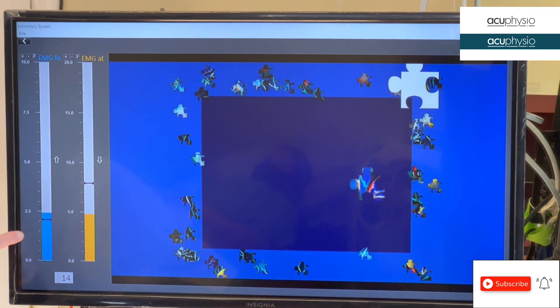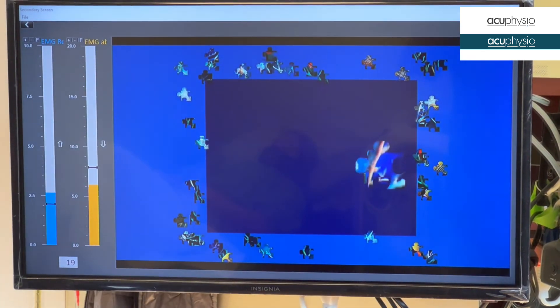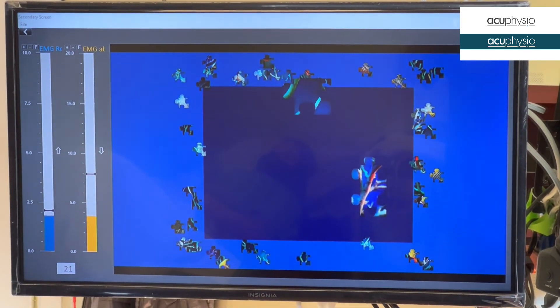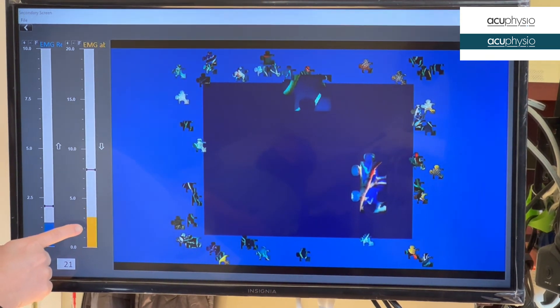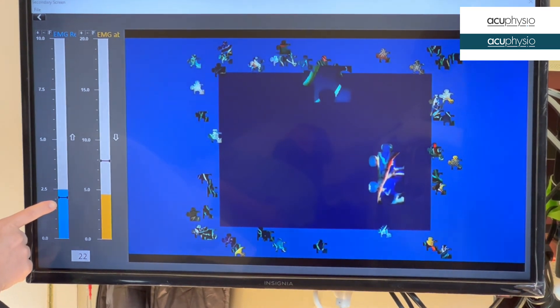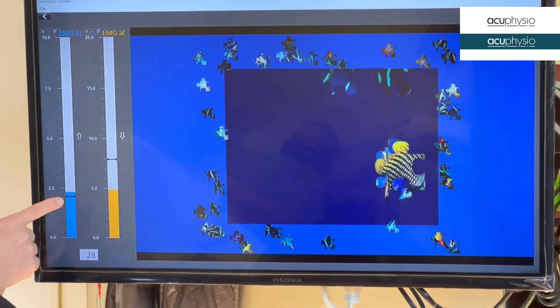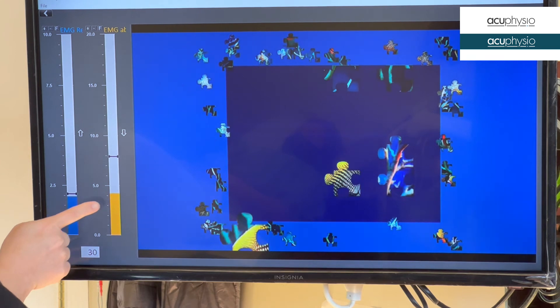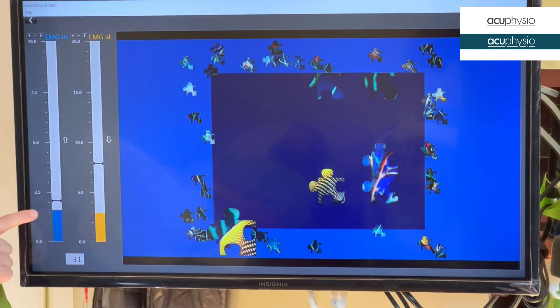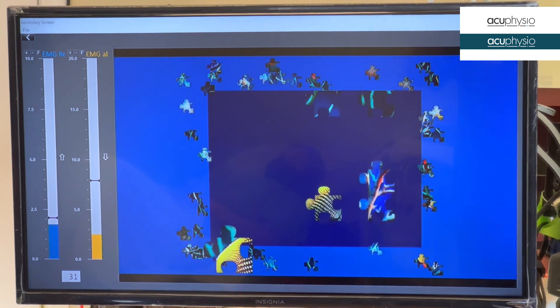Contract. Good. We can see the puzzle is moving now. But you need to relax your abdominal muscle — relax your abdominal muscle. Contract. Good. Awesome! Just like that. Try and do that. I can give you the audio sound if you want to, but if you feel comfortable looking at this graph, I'll give you the graph.